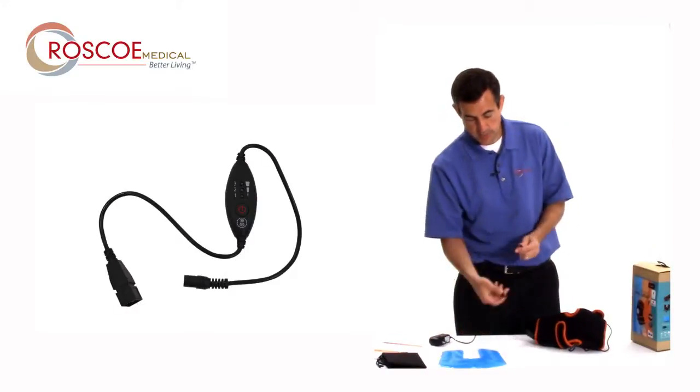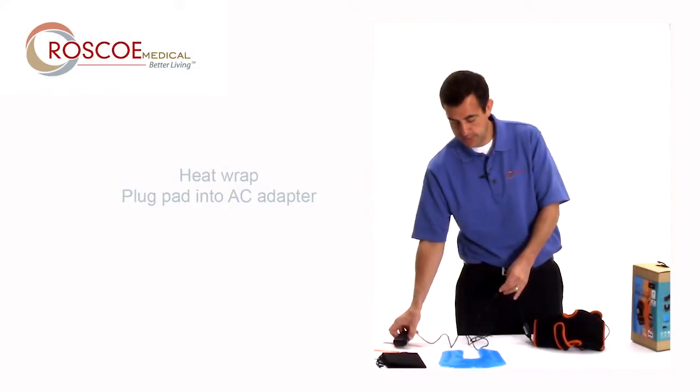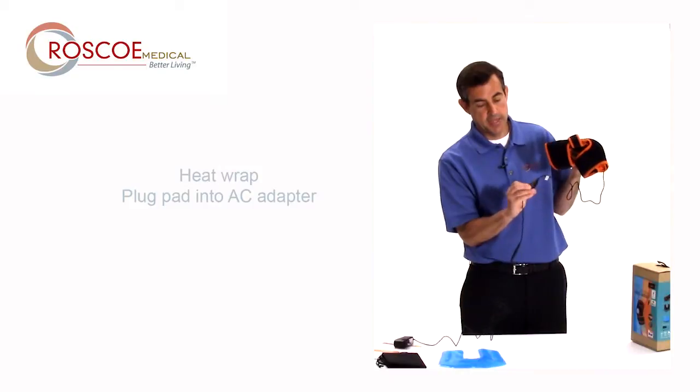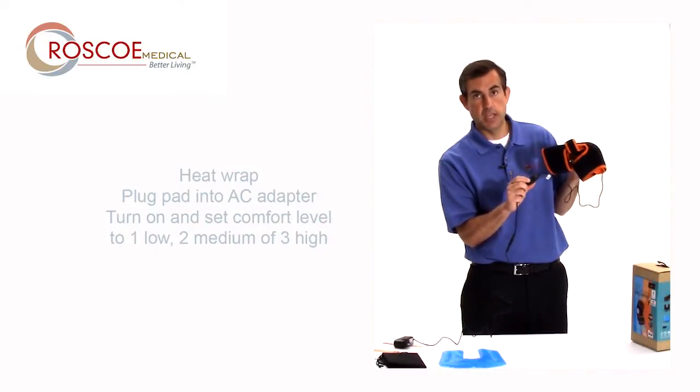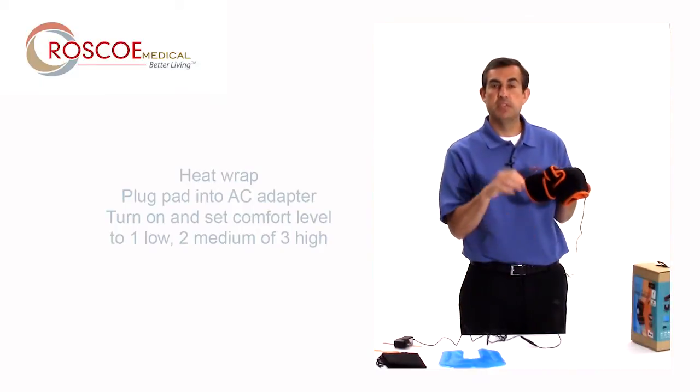If you want to use it for heat, go ahead and plug the heat pad into the connector. Plug this in and simply set it. You turn it on and then it's low, medium, or high — one, two, or three. Very easy to use; set it to your comfort level.